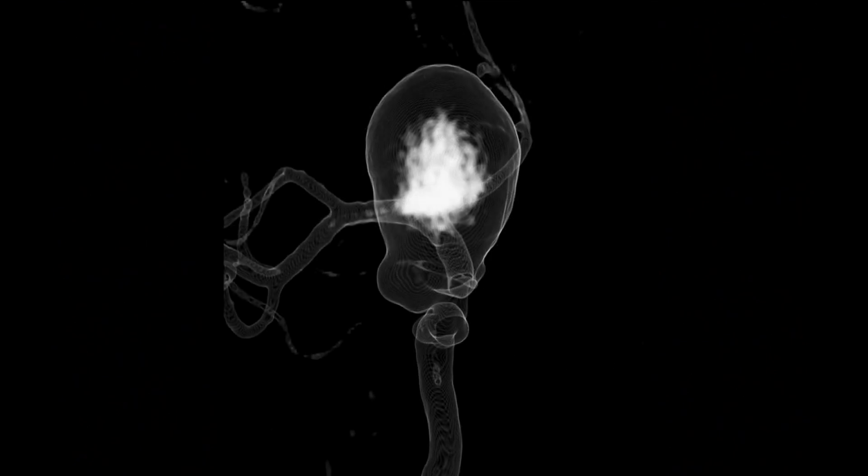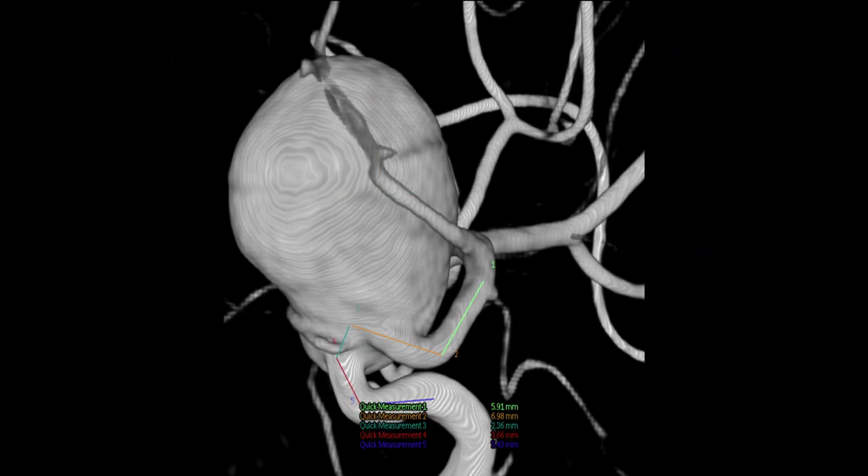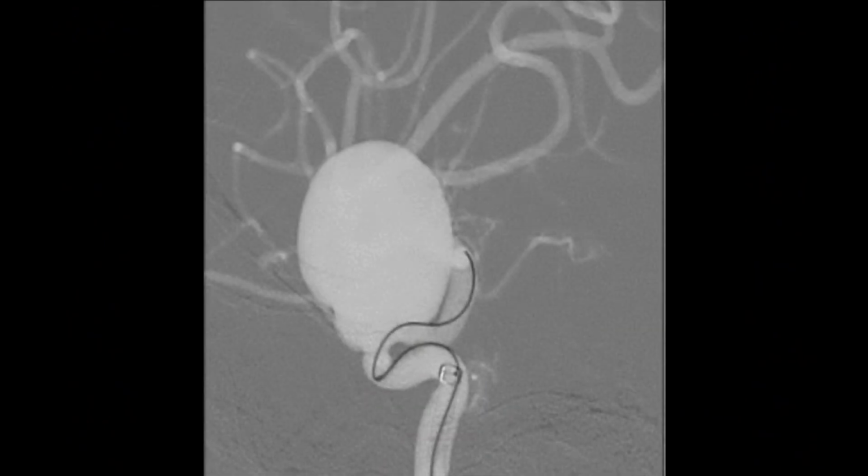This view can tell us the exit of the distal vessel, so we know where to attempt the wire. The sizing can be done, as well as the calculations for the flow diverter placement. The wire taken across using those angles.